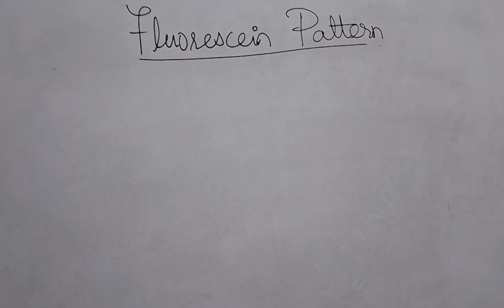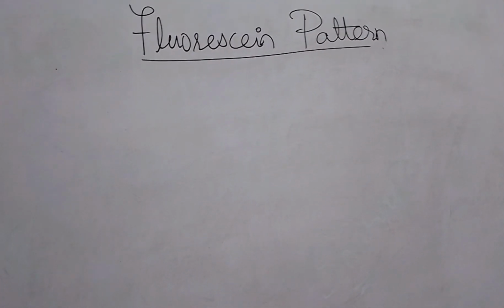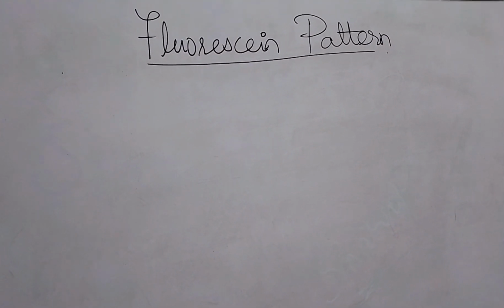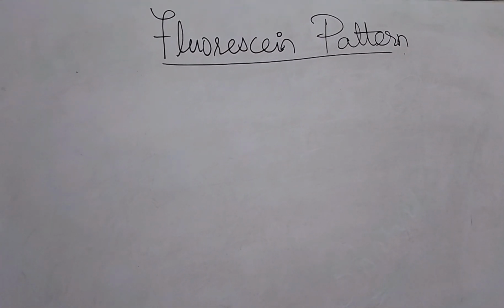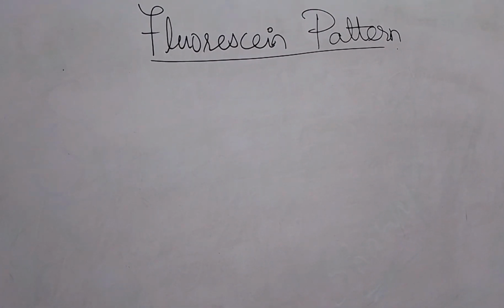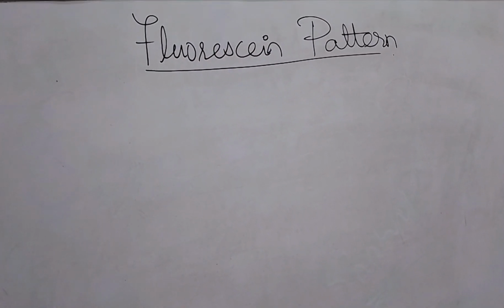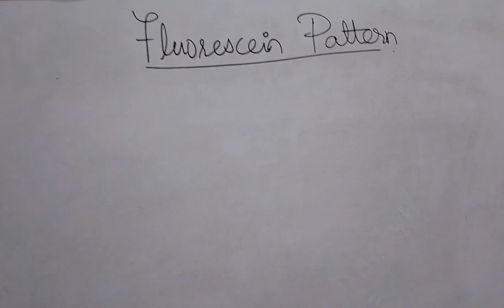As discussed before, today we have to discuss the fluorescein pattern in hard contact lenses. We are going to further include this video in the pattern of hard contact lenses, right? So here we are going to discuss what the fluorescein pattern will be for evaluating the proper fit of the patient who is wearing the hard contact lens, right?